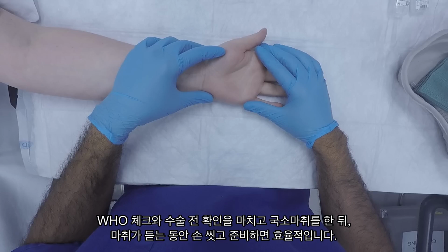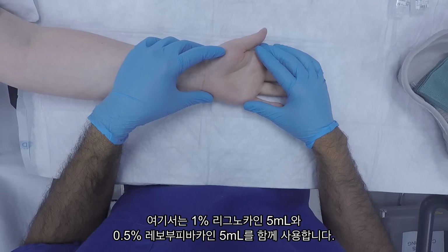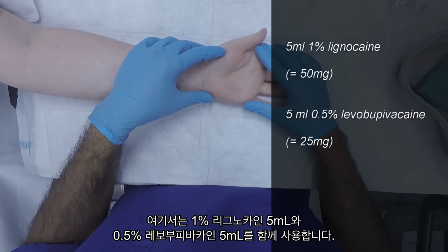As I mentioned before, there are other anaesthetic options such as general anaesthetic, Bier's block, axillary blocks, and so on, but most surgeons tend to do this under local because it's fast and you don't need an anaesthetist. The downside is that you have a bit less time to do the procedure, both due to the limited duration of the anaesthetic block and also because the patient may not be able to tolerate the tourniquet for very long. We're going to use a combination of long and short-acting anaesthetic, and we'll use 5 ml of 1% lignocaine and 5 ml of 0.5% levobupivacaine.